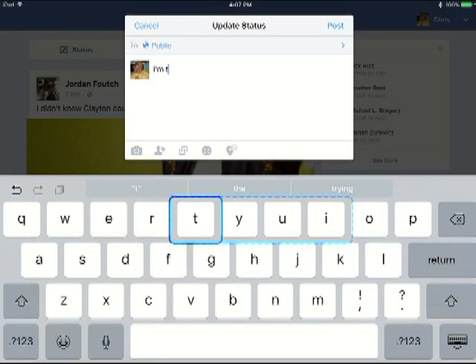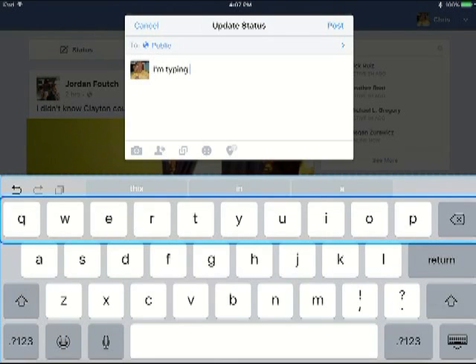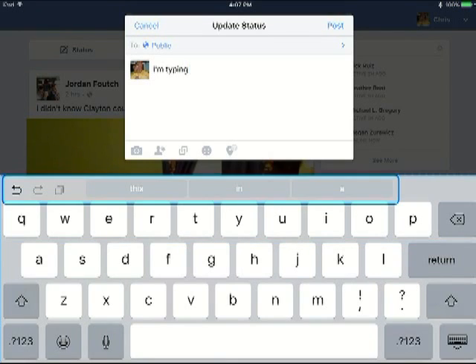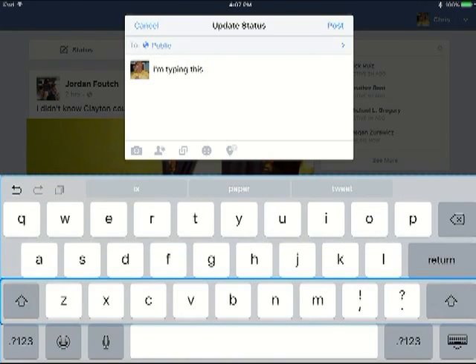It scans each row of the keyboard, and then it separates that row into groups of 4 characters each. The predictive typing feature really speeds things up. All I had to do was type TYP, and it gave me the entire word typing.